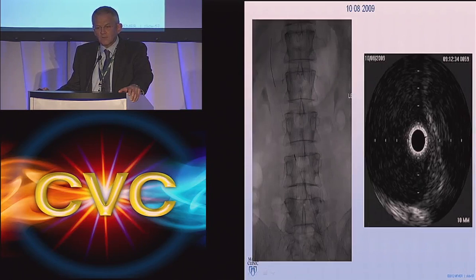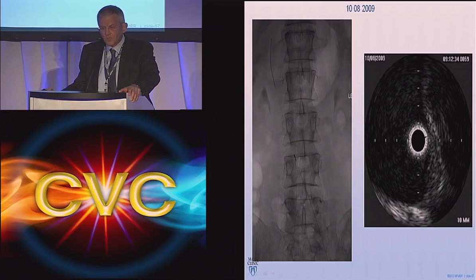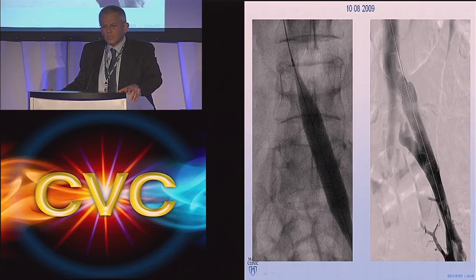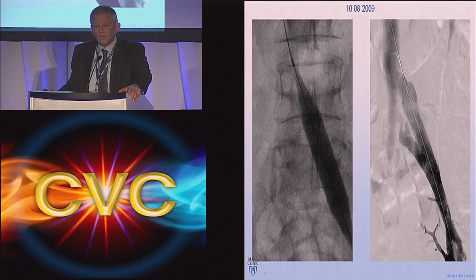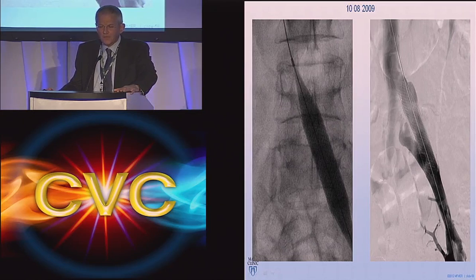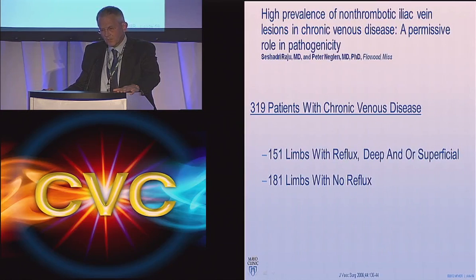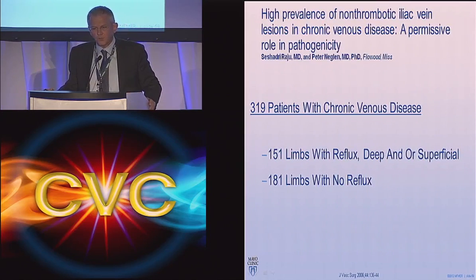Venogram, intravascular ultrasound, which we do not always use, but can be very helpful in cases where there is, well, this is not running, but we let it go. In this case, we decided, based on a 1 millimeter pressure gradient, which we would not consider significant, but because of the look on the IVUS study and on the venogram, and given the clinical history, to stent this, and this patient demonstrated improvement.